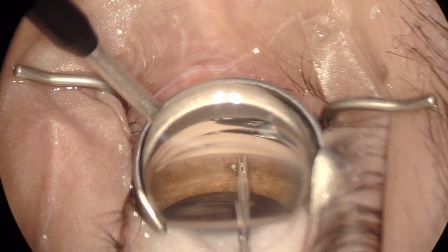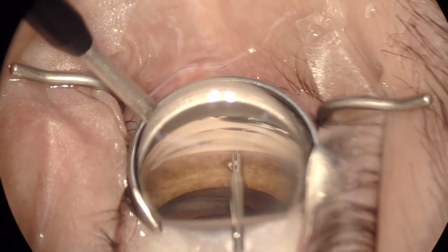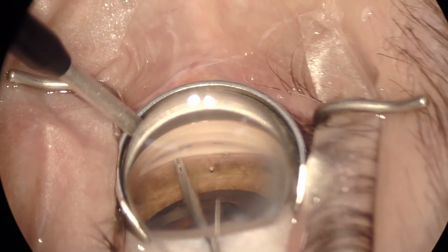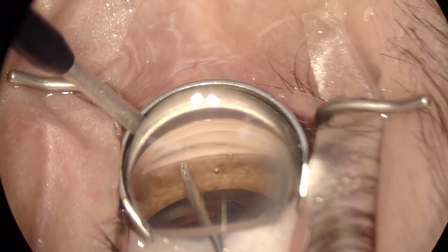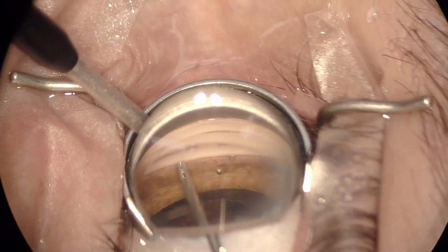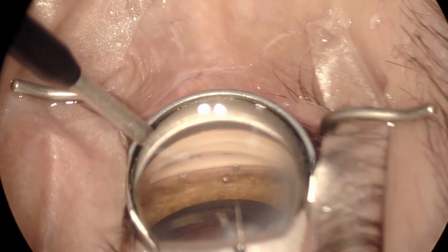This is a case that has a little bit better visualization, so you can see I'm getting ready to deploy the first stent here, and you just have to barely dimple in to fire that trocar. The trocar sticks out from the base of the shaft half a millimeter or so, and all you want to do is just have the base of the shaft touching the TM, and that'll allow adequate pressure to deploy the stents. Here I'm a little bit narrow, meaning I'm only about a clock hour apart, but again, the goal is to get the 2 stents in, and I felt that I had good pigmentation, which is where I like to target the stents. And so you can see how those stents are sitting there looking back at you in the trabecular meshwork in good position, about a clock hour apart or so.